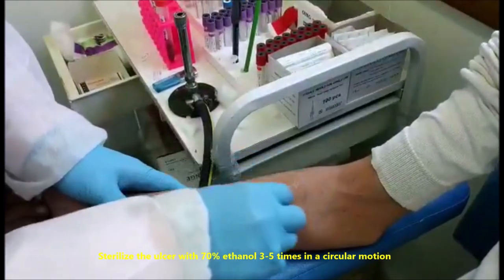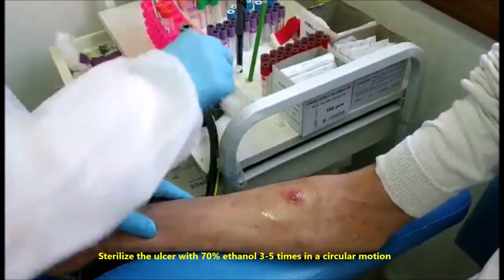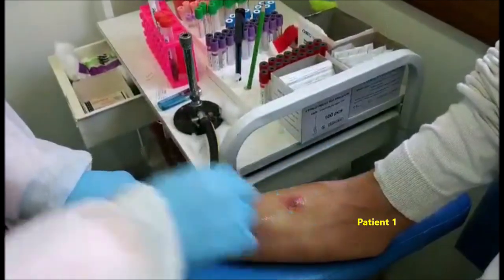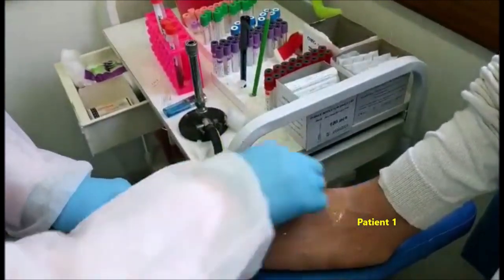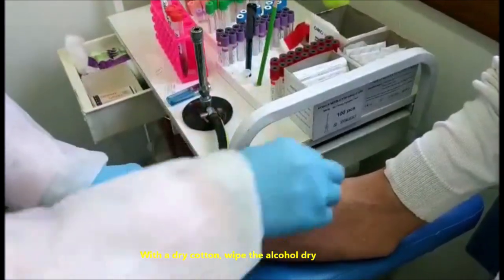Sterilize the lesion with 70% ethanol, 3 to 5 times in a circular motion. With a dry cotton, wipe the alcohol dry.